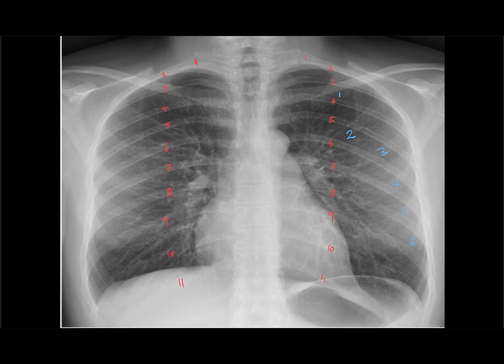Lastly, this is the radiograph of a man. If it were the radiograph of a female, you're going to see the shadow of the breast by this side. But since there's no breast shadow by the sides, then this is the radiograph of an adult male.